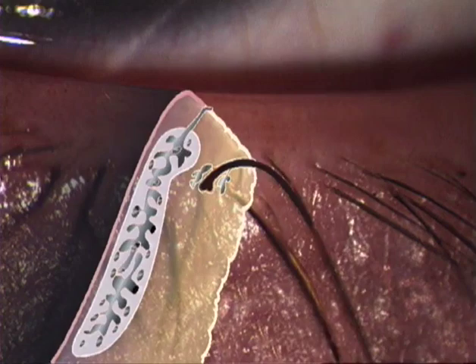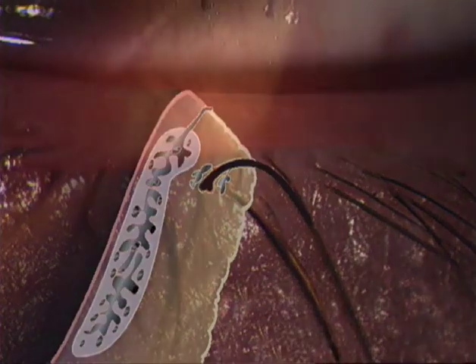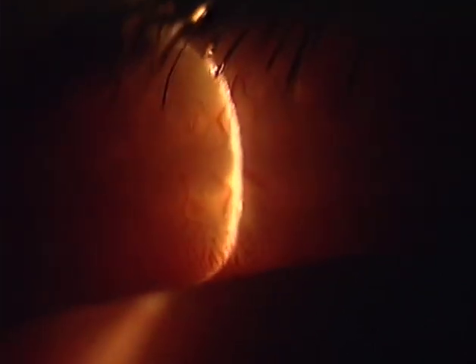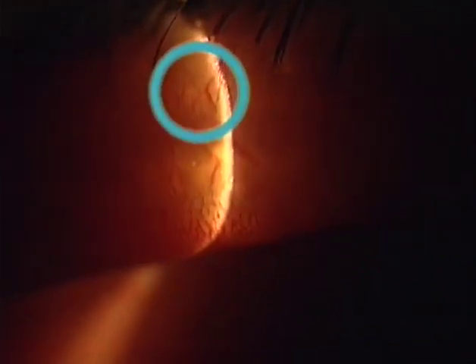In the normal lid, the accessory sebaceous glands at the ciliary roots can be seen through the covering layers and be recognized by their yellowish tinge. In indirect illumination, the outlines of the sebaceous glands can be made out in more detail. After the light beam has been placed just at the right-hand side of the target, the gland is observed on the left of the illuminated area.